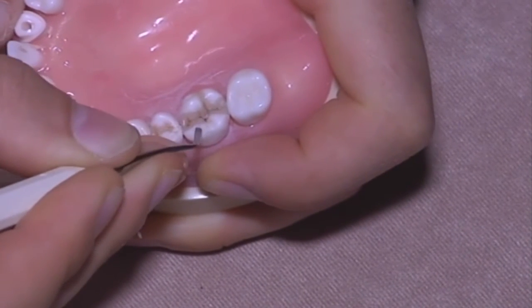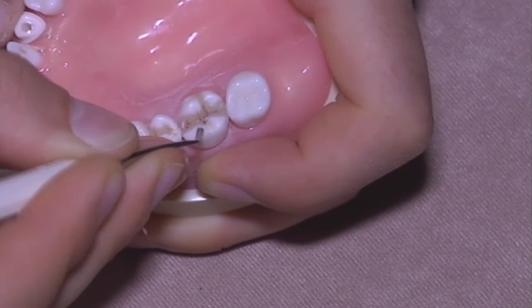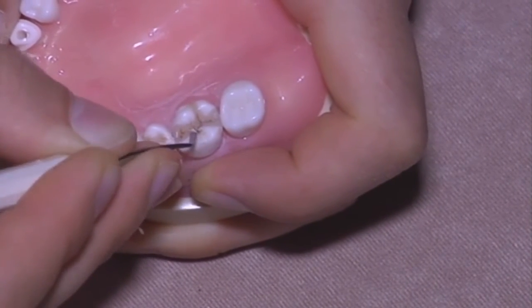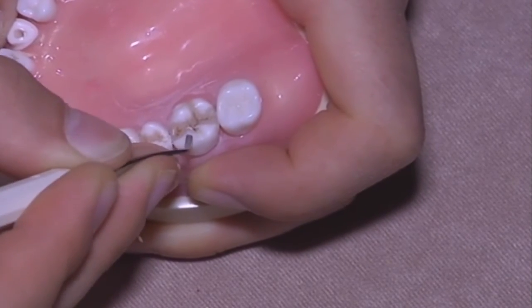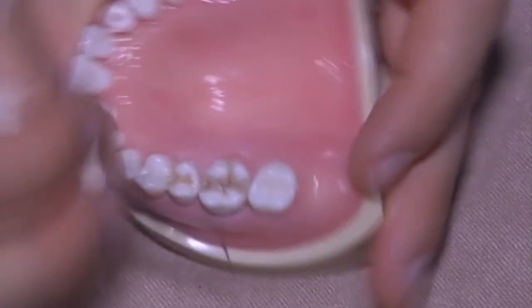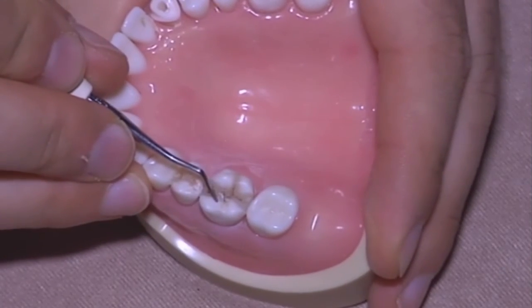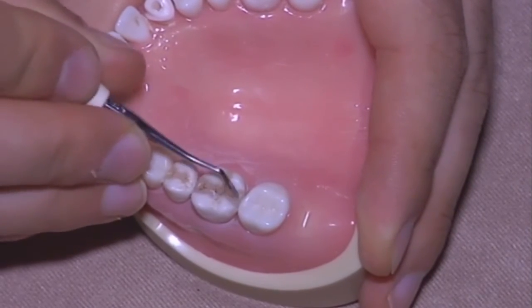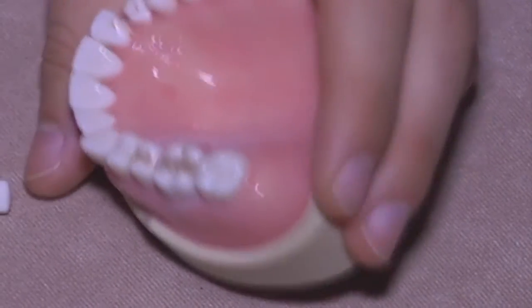And in reality I used to remove this amount of composite, which happens to be on the occlusal surface, with a red ring bur, as I told you. Okay.